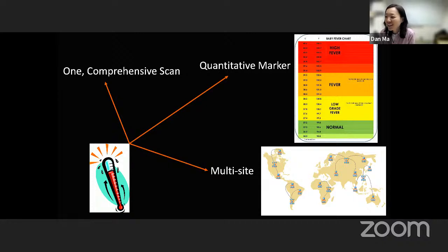Other artifacts as well, I guess, because the reason we can make MR fingerprinting so fast is that we applied a very high undersampling rate. The result of the undersampling is that there are many aliasing artifacts in the images. Through the template matching, we can get rid of these aliasing artifacts as well. So that means, in terms of artifacts, that can be from motion, aliasing artifacts, thermal noise, or measurement errors as well.